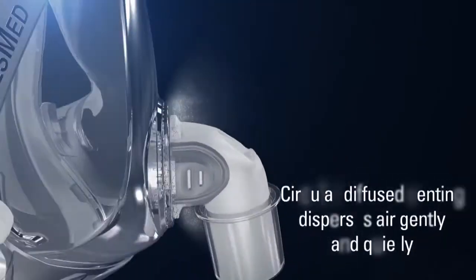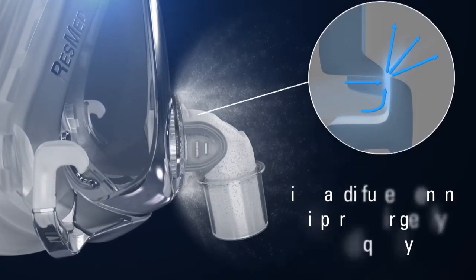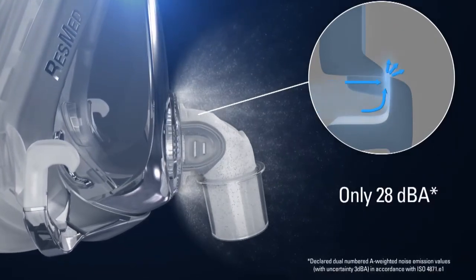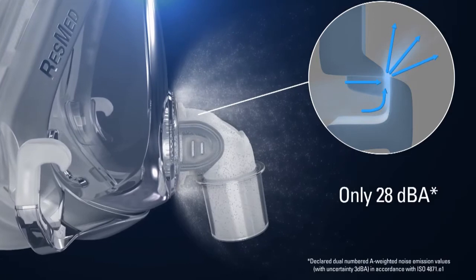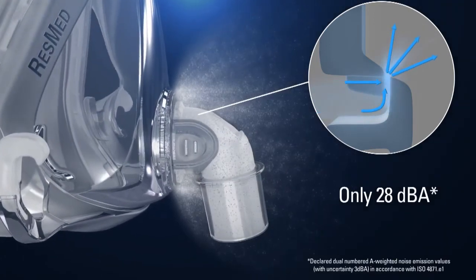Advanced circular diffused venting ensures that Quattro Air delivers quiet mask performance with a sound power level of 28 dBA. Air is dispersed gently and quietly away from the user and their bed partner, so both can enjoy a quiet, comfortable night's sleep.